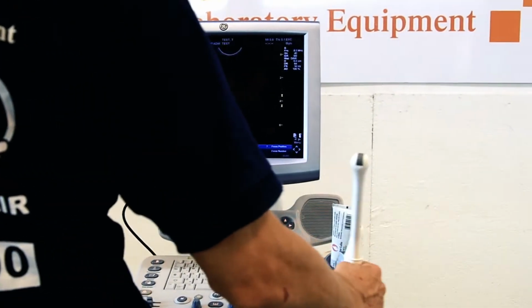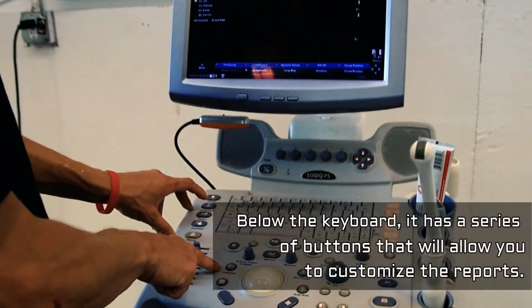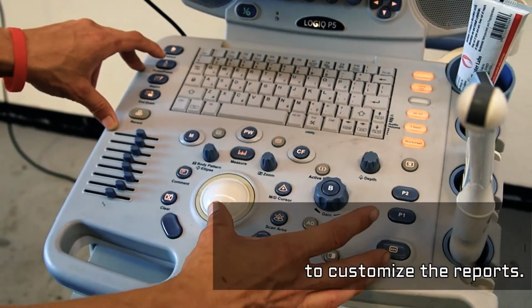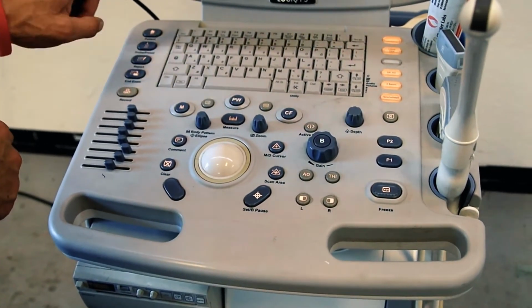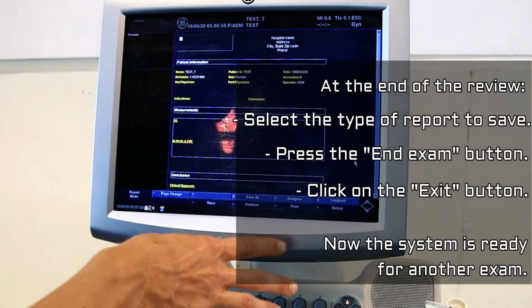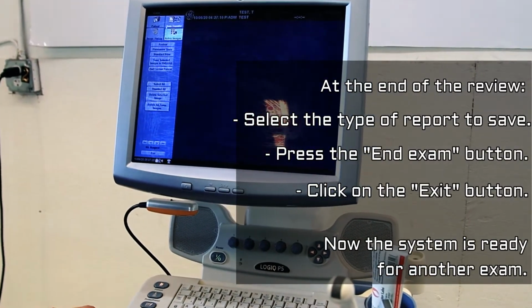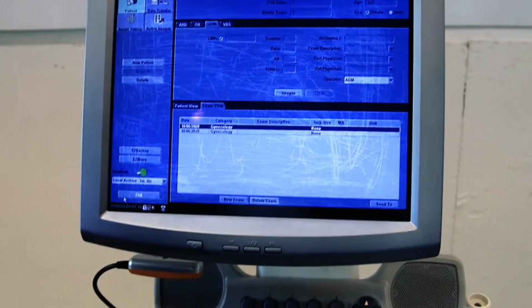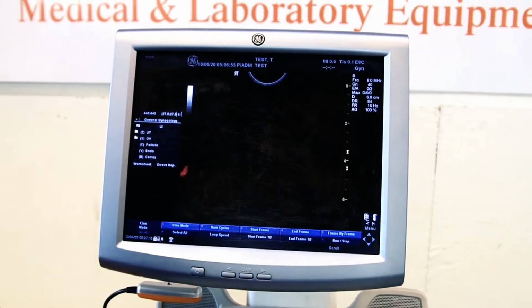Very, very simple. Once you're finished with the procedures, you can actually use comments here. You can do your cursors. There are a lot of different options to customize the report, because once you're done with your patient, you can hit the report button. It'll come up with any notes or comments that you put in it, whatever the case may be. And then once you're done there, all you have to do is simply end the exam. It'll save the patient information, of course. And then you're done. All you have to do is exit the procedure, and then you'll be ready for the next one by doing the same thing.